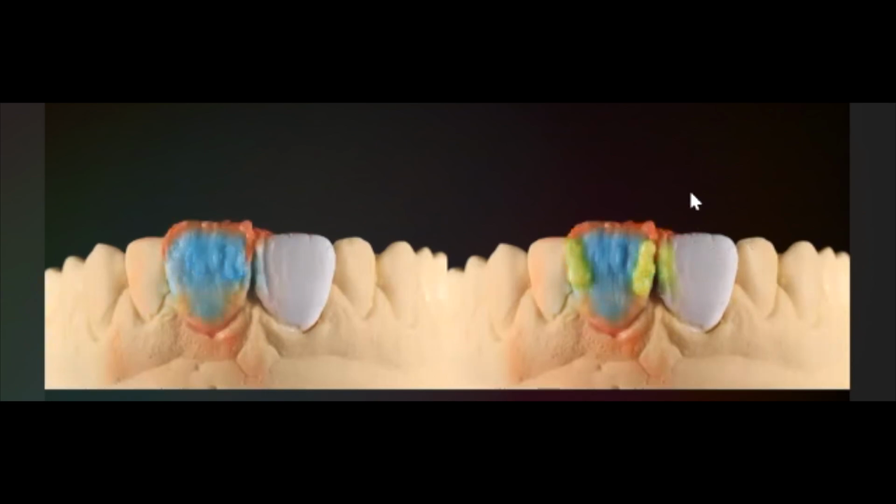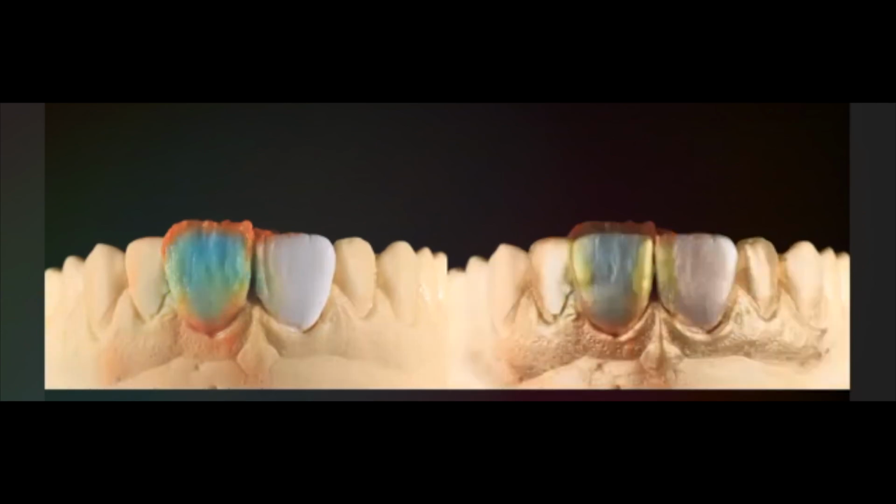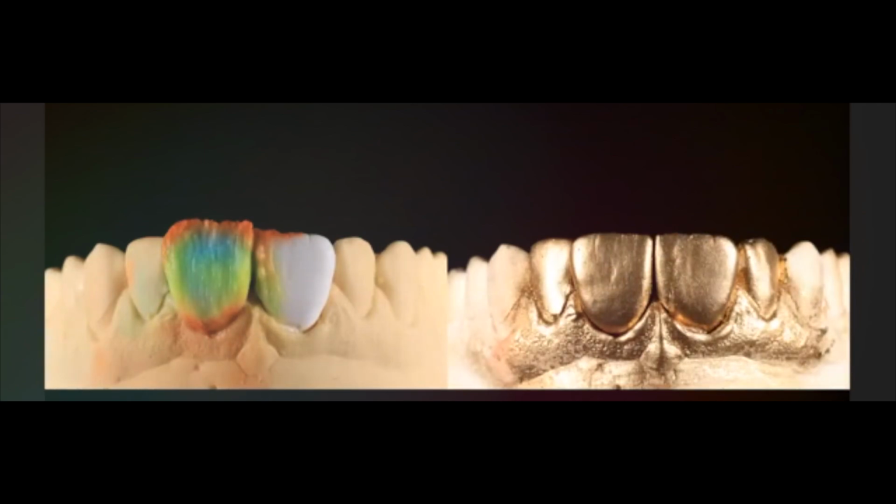Halo effect, and then ELT2 is a more bright enamel to the line angles. So we need to keep the brightness high because a young person has a lot of value, okay, a lot of translucency, but the value still remains at a high level.